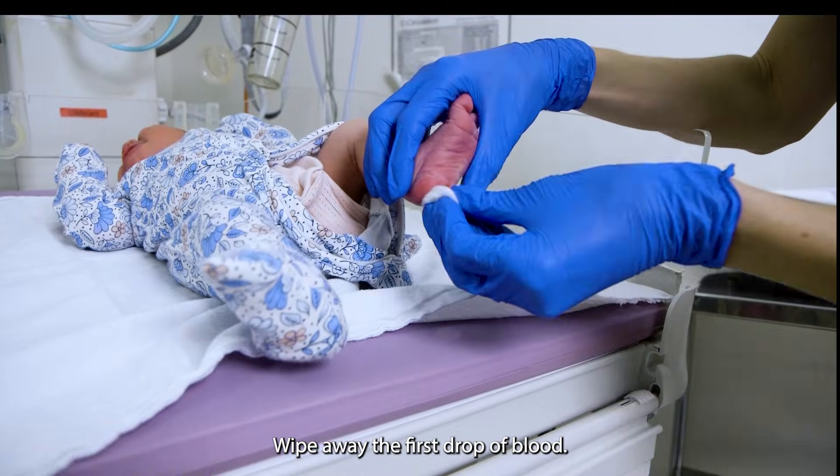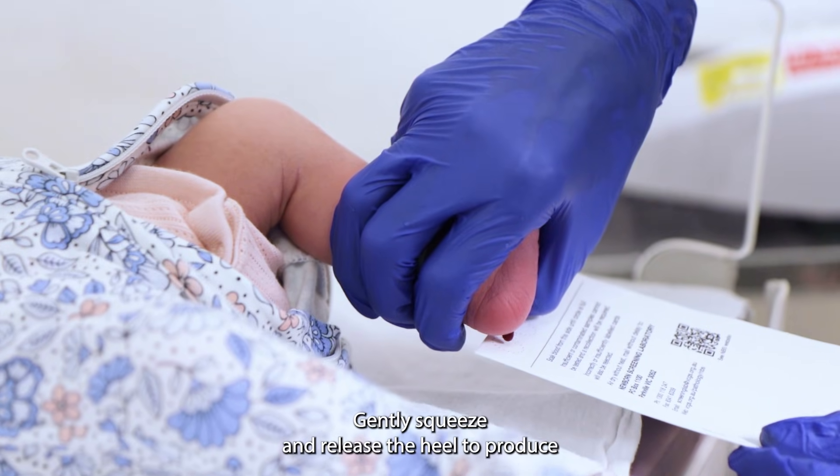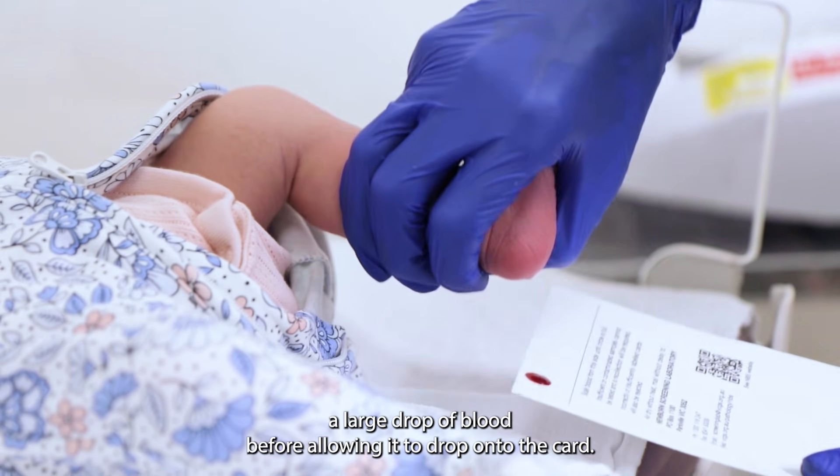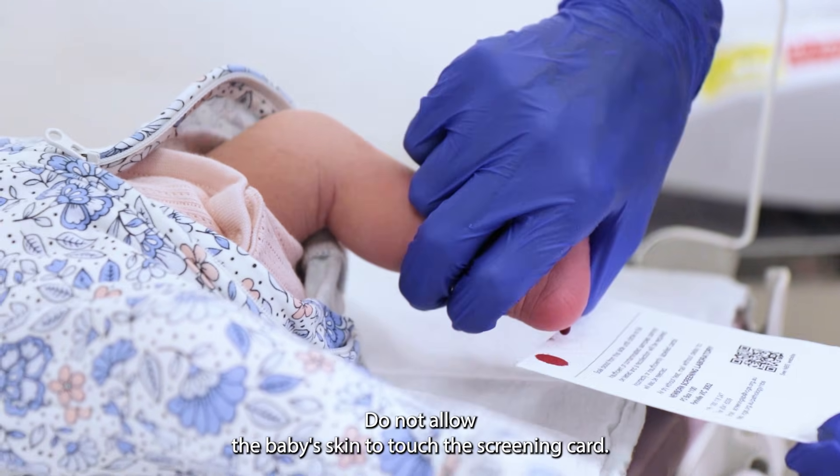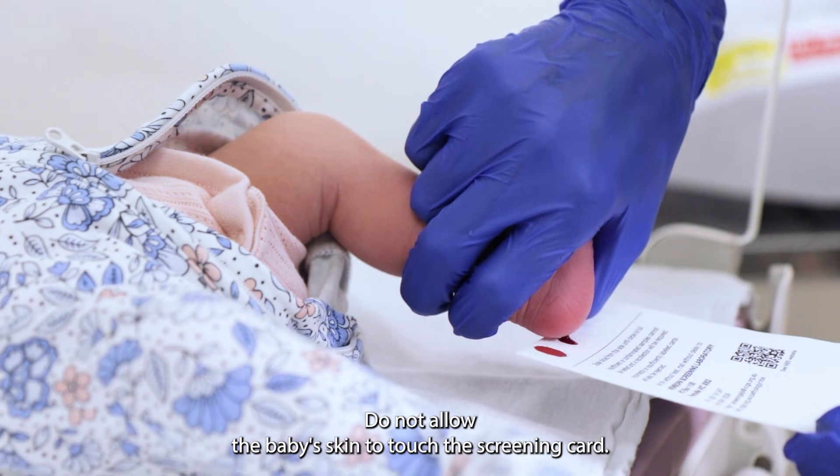Wipe away the first drop of blood. Gently squeeze and release the heel to produce a large drop of blood before allowing it to drop onto the card. Do not allow the baby's skin to touch the screening card.